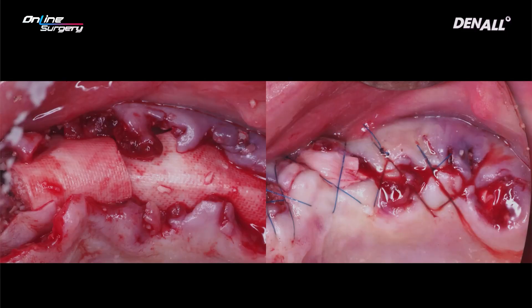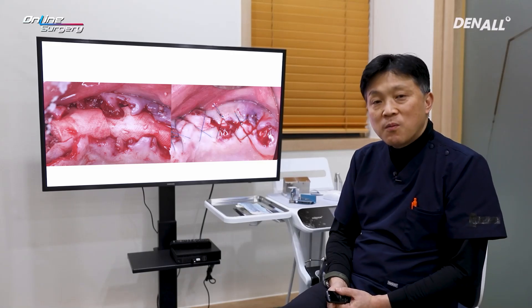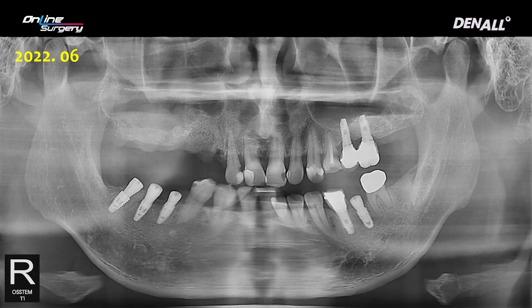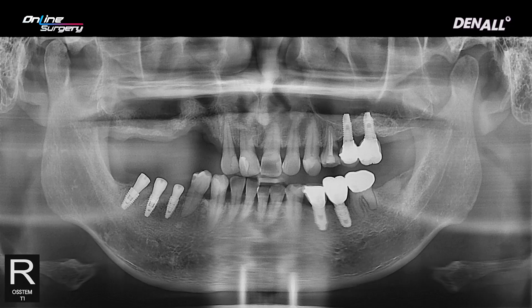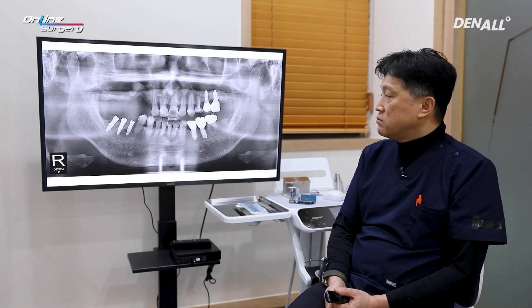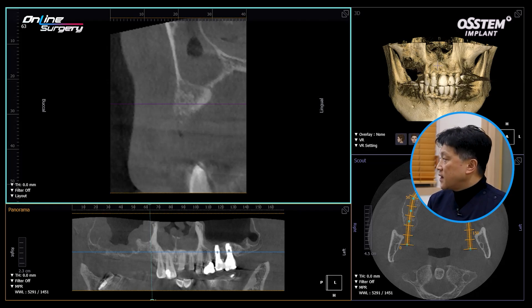It would have been best if bone had been formed with surgery. Looking at the immediate post-op panoramic image, it's shown that with healing, no bone formation occurred and there was a defect yet again. Looking at the CT at the time, there was membrane thickening, and I think this problem erupted due to the patient's upper respiratory infection.